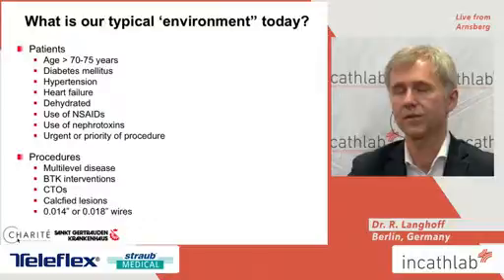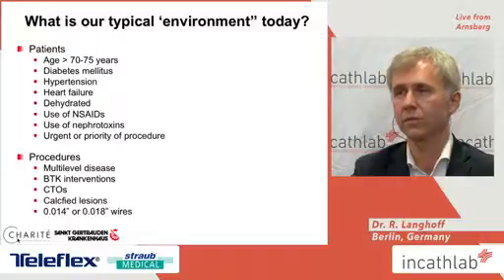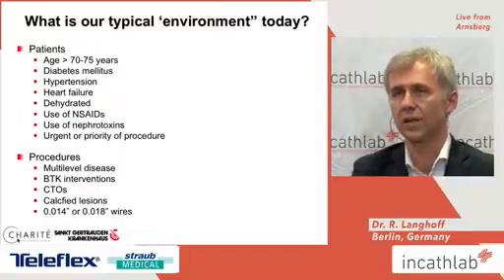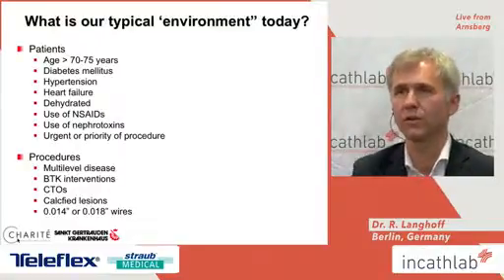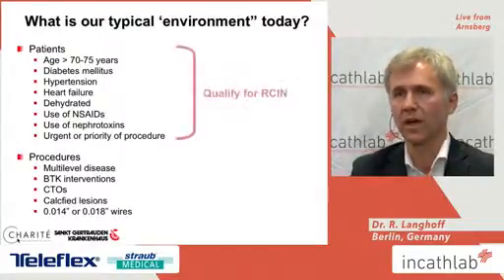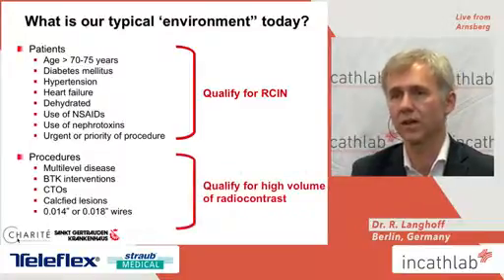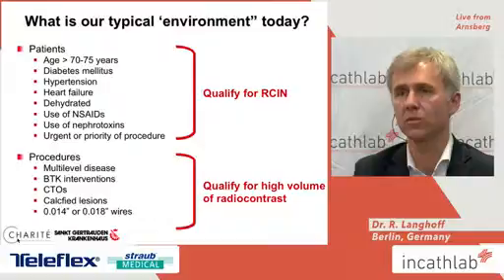And the procedures themselves, mostly we have to face multi-level disease. Mostly they are going to include BTK interventions. There are CTOs, and we see more and more calcified lesions, approximately 40% of those cases. And I think there is a trend that the usage of 014 and 018 wires is becoming more and more common. I think all those patients qualify for radiocontrast-induced nephropathy, and the procedures themselves also qualify for a high volume of radiocontrast. So I think it's quite an important option.